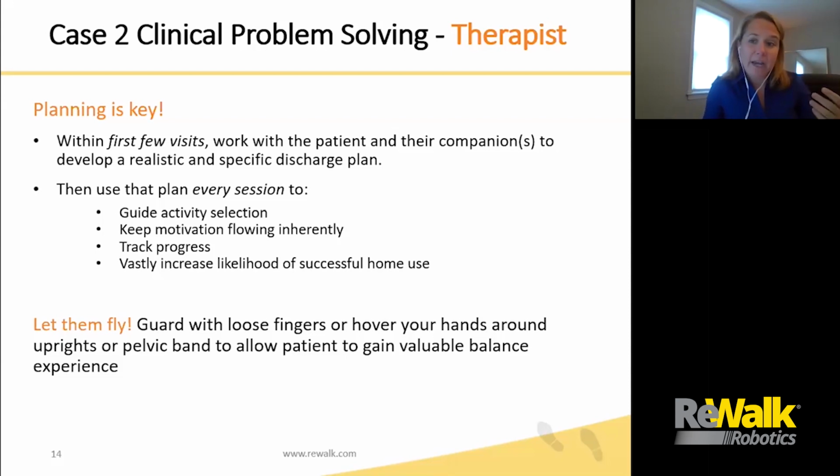Just like any other patient that you're doing gait training work with, if you don't ever allow them to have a little bit of failure with their balance, they're never going to learn to have those balance recoveries on their own. So when you're confident in their crutching, you don't have to go from hands-on to nothing, just a really light grip or just a slight hover. So you're definitely there for them, but you're allowing them to grow and then fly.